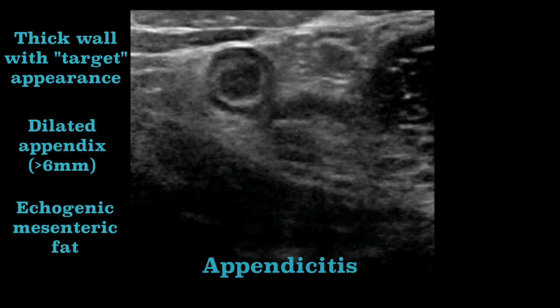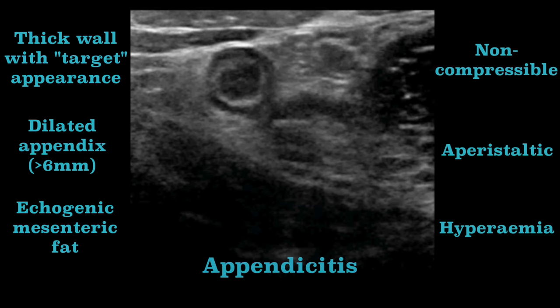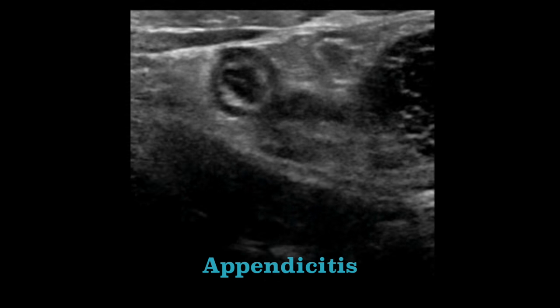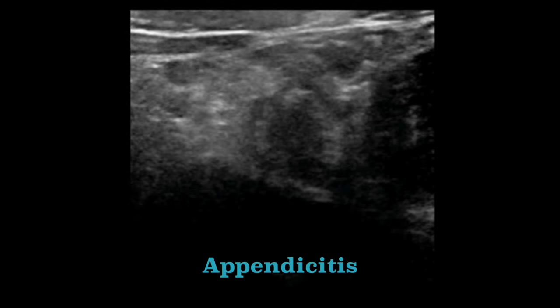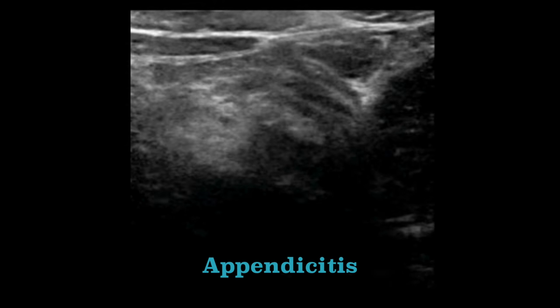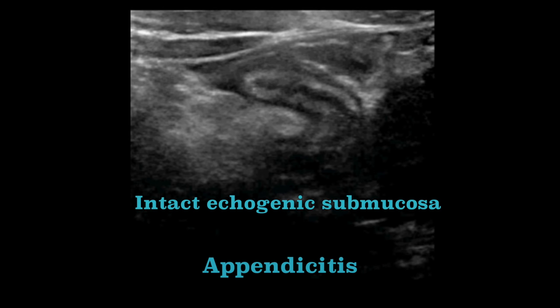But there are even more things to note with ultrasound. As ultrasound is a dynamic test, you can also look for compressibility and for peristalsis. The absence of both of these features further suggests appendicitis. Colour Doppler assessment allows you to look for hyperemia, which is another useful supportive feature. In this example, we can see that the submucosa, although echogenic, is intact.